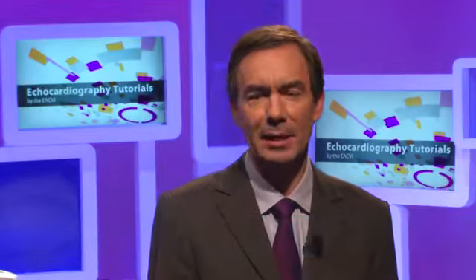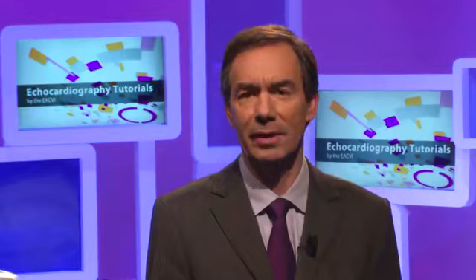Patricio Lancelotti will present the assessment of primary mitral regurgitation in a patient with degenerative mitral valve disease. He will first present the main important features at the level of the morphology of the valve using multiple views. Then he will move to how to quantitate the severity of mitral regurgitation with the different methods available. And finally, the consequences on the left ventricle and the left atrium.